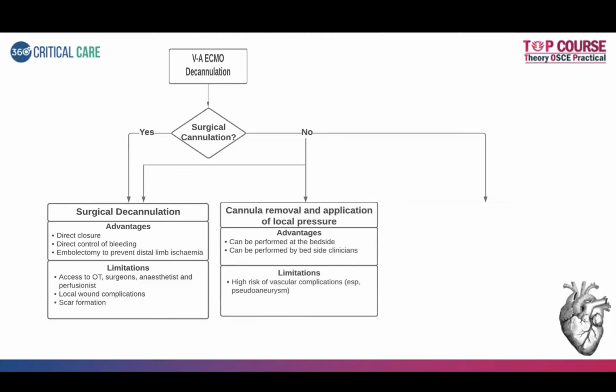Whereas if it is not a surgical cannulation, usually either surgical decannulation can be done or cannula removal and application of local pressure can be done. This can be done at the bedside itself by bedside clinicians. But the issue is there is a high risk of vascular complications like pseudoaneurysms.